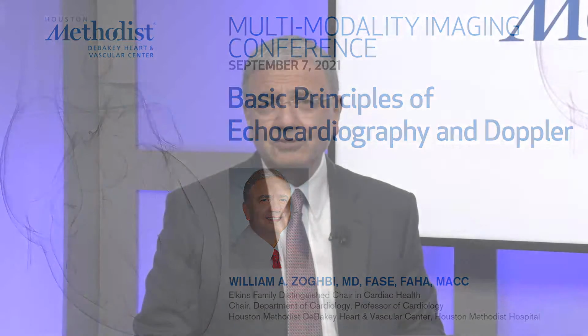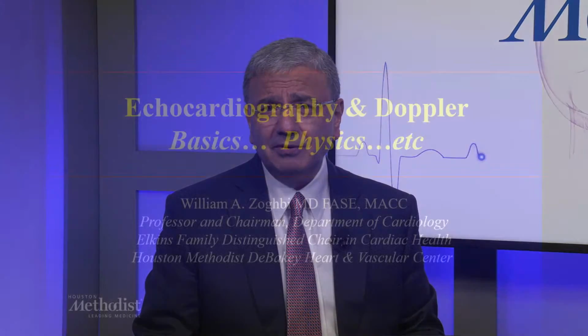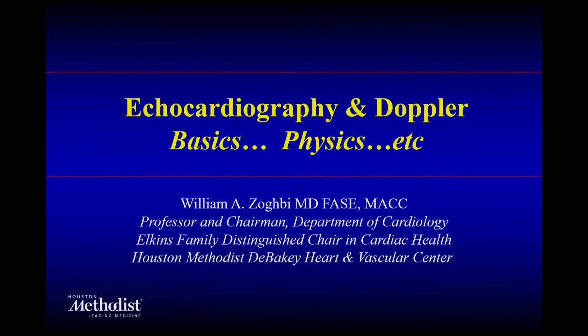I'm William Zoghbi. I'm the chair of cardiology here at Houston Methodist, and we usually start with general topics in imaging. So this one is no stranger to any of you. We'll start with echo Doppler, the basics, physics, but also in the next few weeks we will be addressing the basics of CT, cardiac MRI, nuclear, as well as PET.